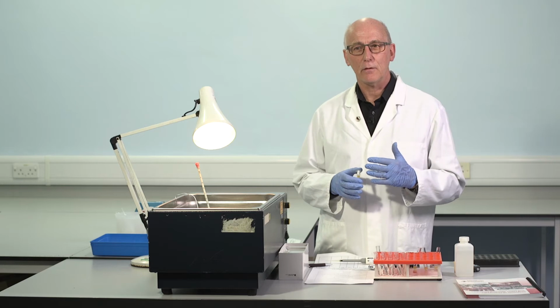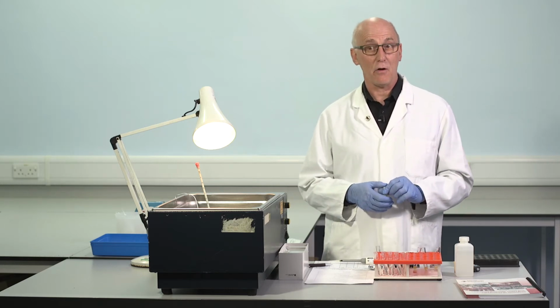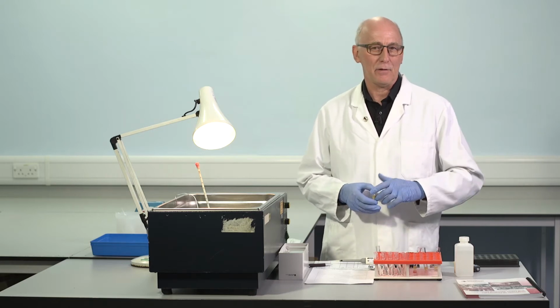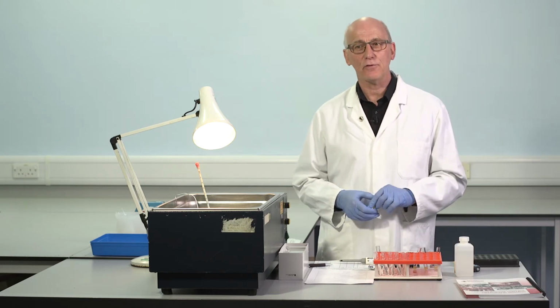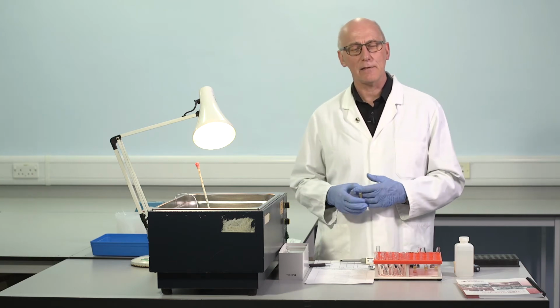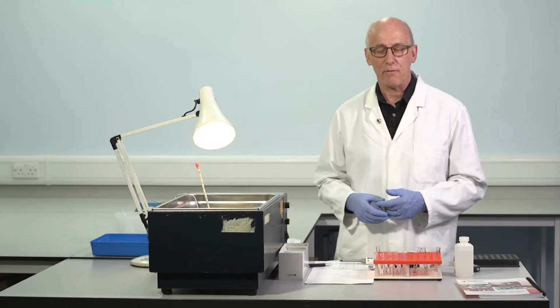Patient samples are not freeze-dried. They're either a fresh sample which has not been frozen. That will be the case if we make the assay within 4 hours interval between collection and testing. The sample's not been frozen. Sometimes the sample has been frozen if we want to take advantage of efficiencies of assaying several samples together, particularly for diagnostic samples, that might be fine.